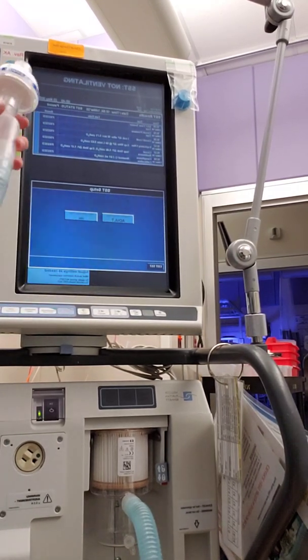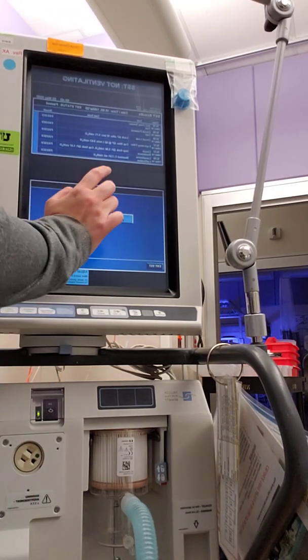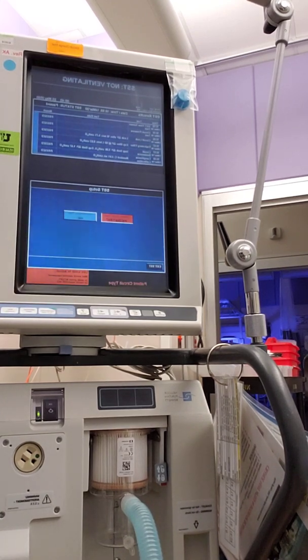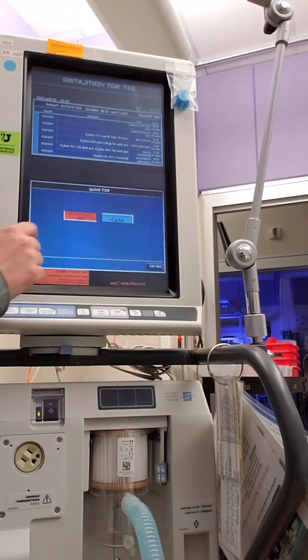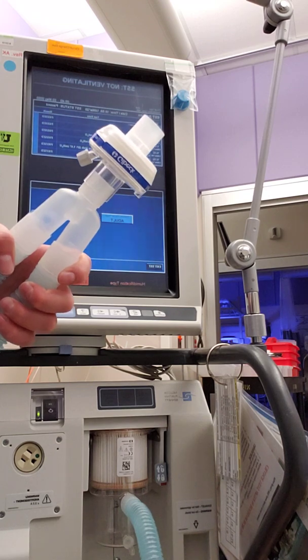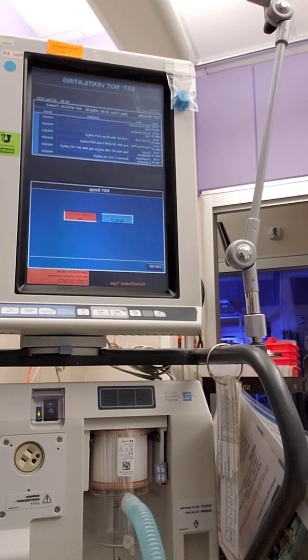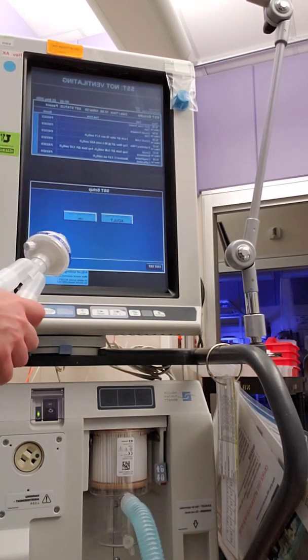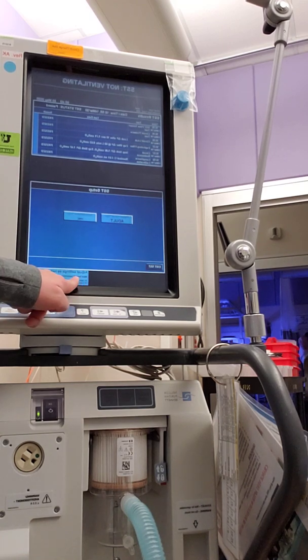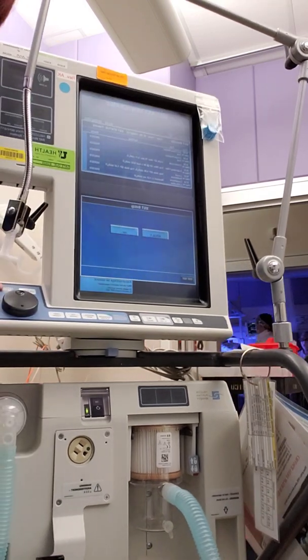And we have an adult circuit. We grabbed an adult circuit, and it's one of the bigger circuits. You can change it to pediatric or adult depending on what software is uploaded. Next we have the humidification type, HME, which we have, or you could do a heater. Since we are doing an HME, we will choose HME. So you can adjust settings as needed, and then we must match installed equipment, and then we hit accept. So the accept button right here.